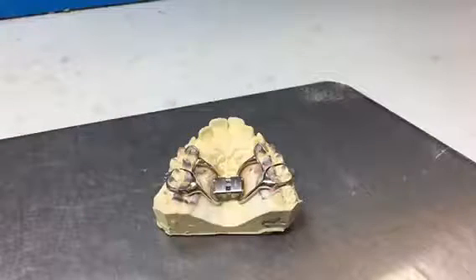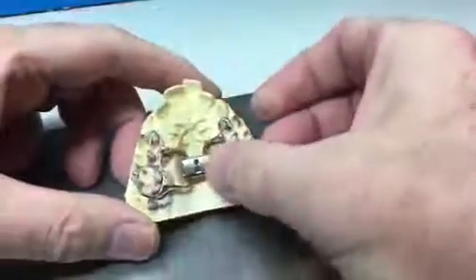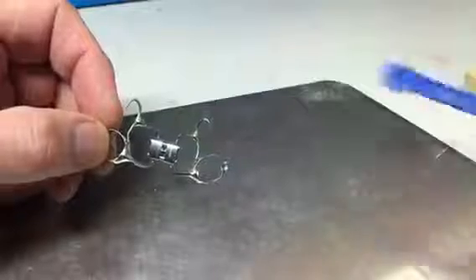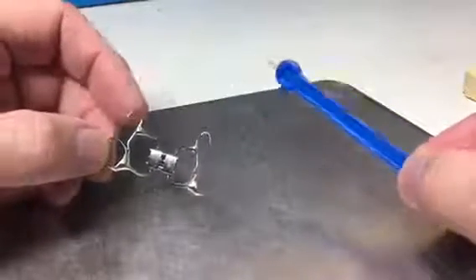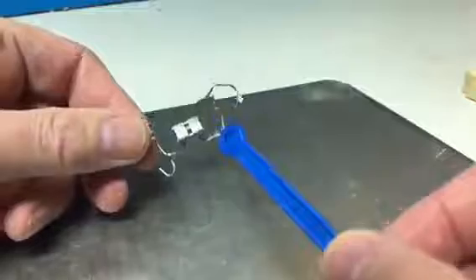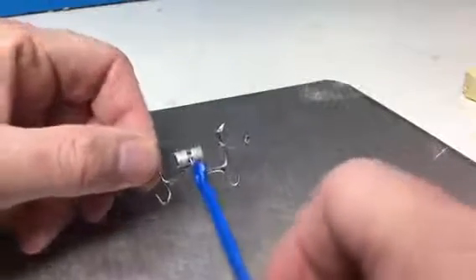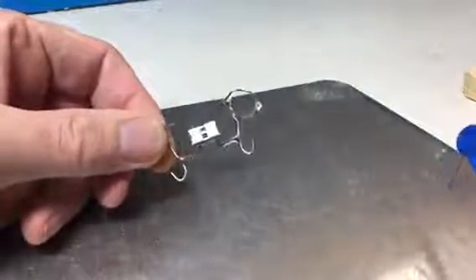This is a fixed expander — it stays in the mouth, obviously it's cemented in. To activate this you're going to need a different type of key, one of these blue swivel keys. Again, this comes with the appliance. The patient or the parent activates this by finding the little hole, putting the blue swivel key in that little hole and just turning like that. That's one quarter of a turn for this appliance.